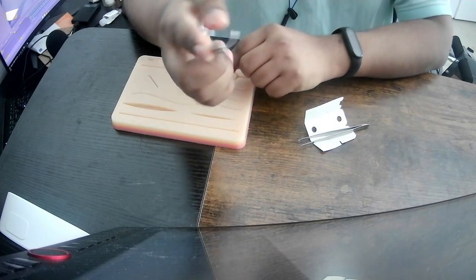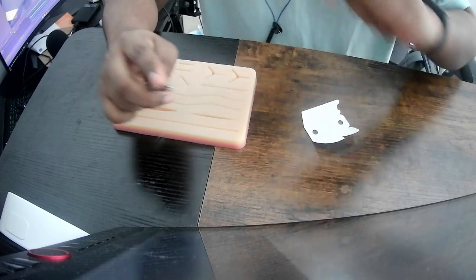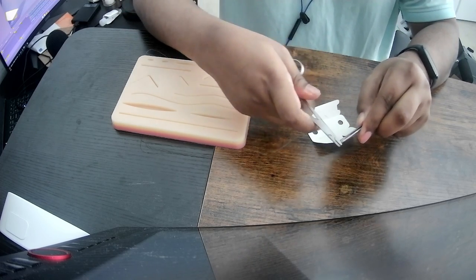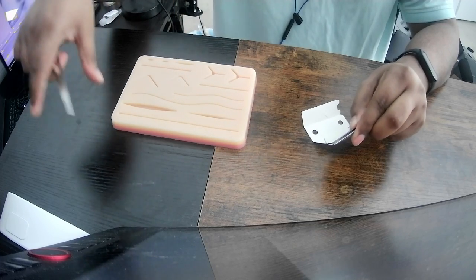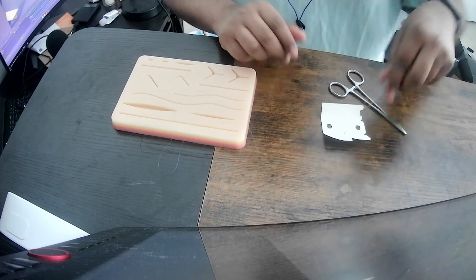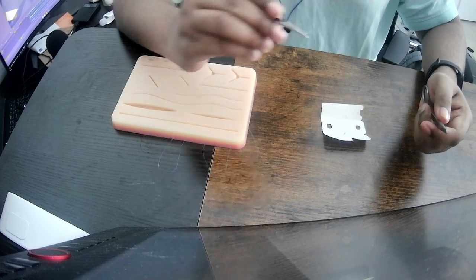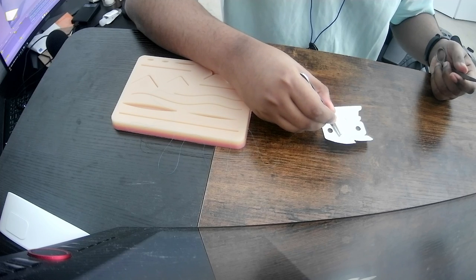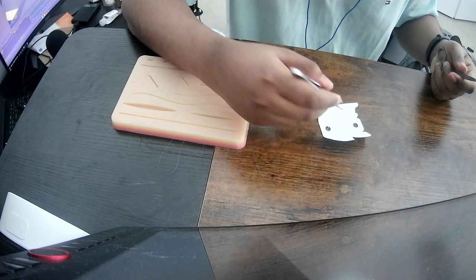Needle's loaded. Suture's ready. And I'm ready to drive it, I guess. Let me try one more time and then I'll try it on the skin. Okay, so load it on the Addison's forceps. Gently unlock. Okay. This is working okay. Let me try with the other hand. Gently put it back. Now I'll be using the needle driver with my left hand and the Addison's forceps on the other. This is my dominant hand, so I don't expect too much trouble. I think it's kind of finicky. It's a weird needle.